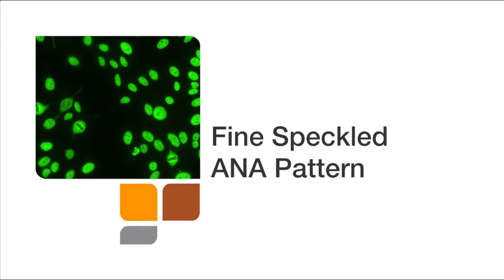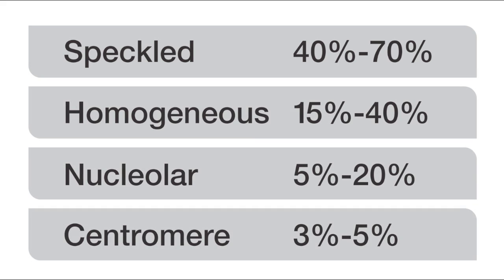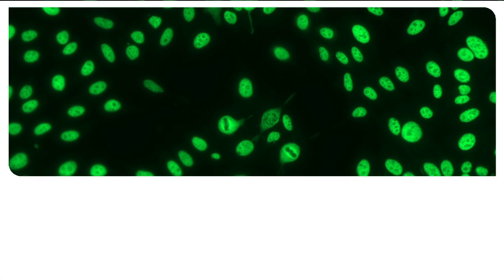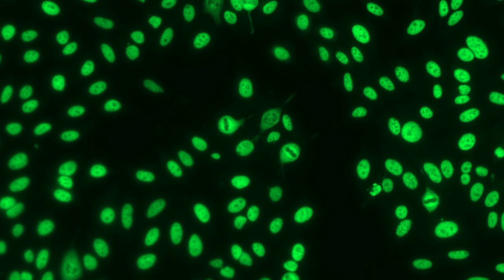The IFA pattern for today is fine speckled. The speckled pattern, both fine and coarse, is the most common ANA-IFA pattern and is seen in about 40 to 70% of IFA positive samples. Now let's take a look and see what a fine speckled ANA-IFA pattern looks like.